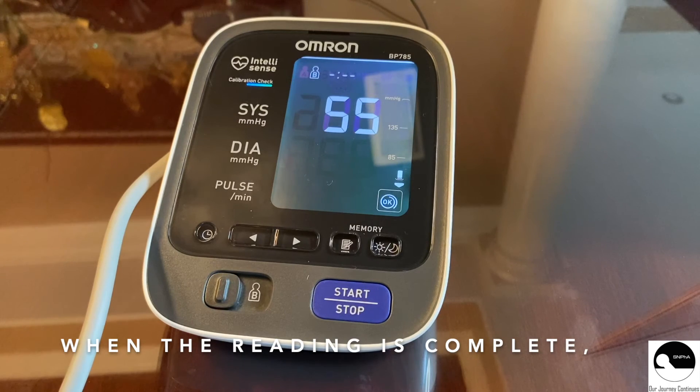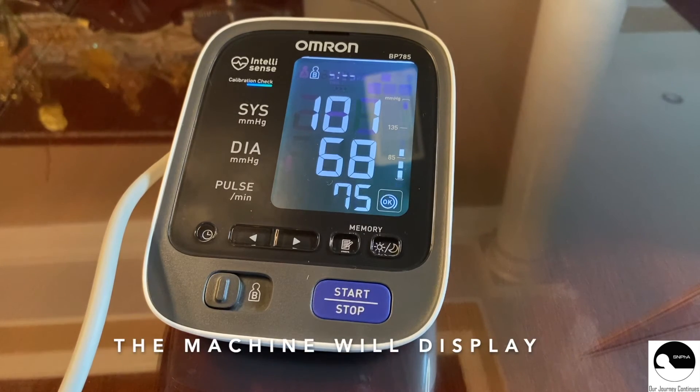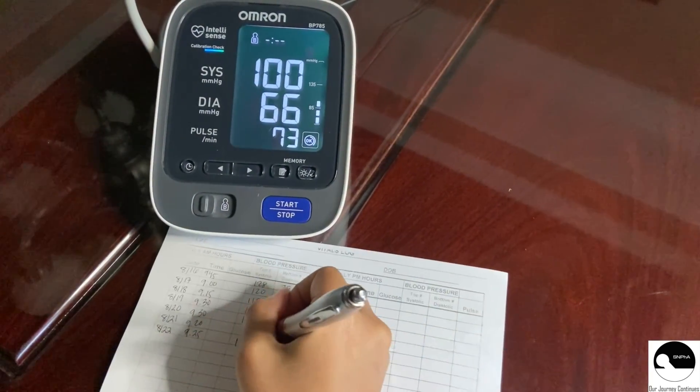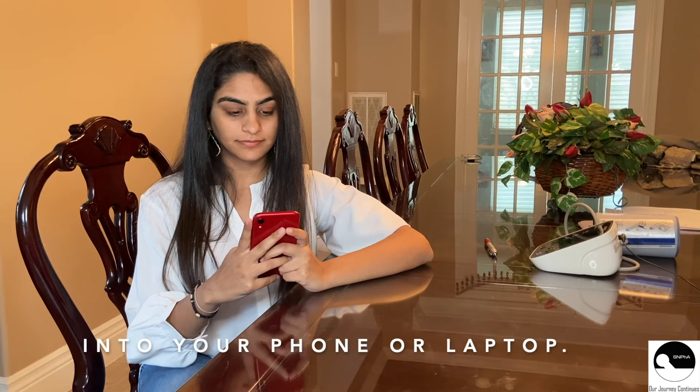When the reading is complete, the machine will display the blood pressure reading. Record your numbers daily either by writing it down in a journal or entering it into your phone or laptop.